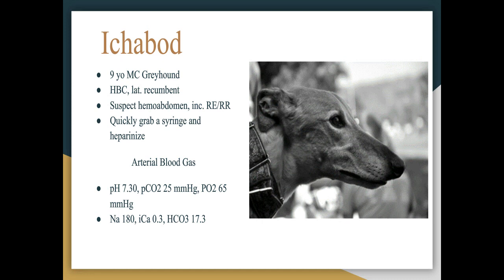As we discussed before, a dilutional effect may also occur when using sodium heparin. This may cause abnormal CO2 results, which can also affect your bicarbonate results, as well as oxygen results. And it would probably be recommended to redraw a sample using only 1 to 5 units of heparin.